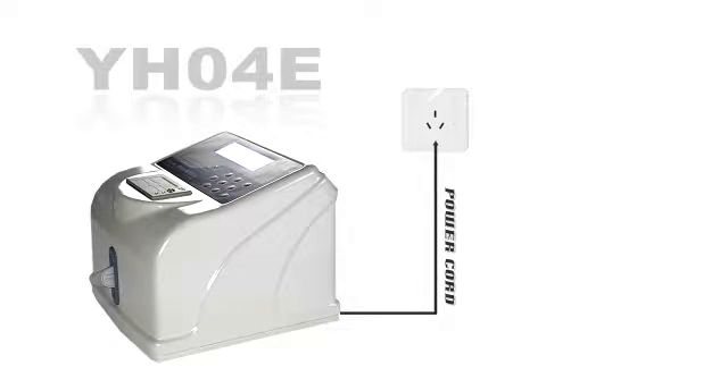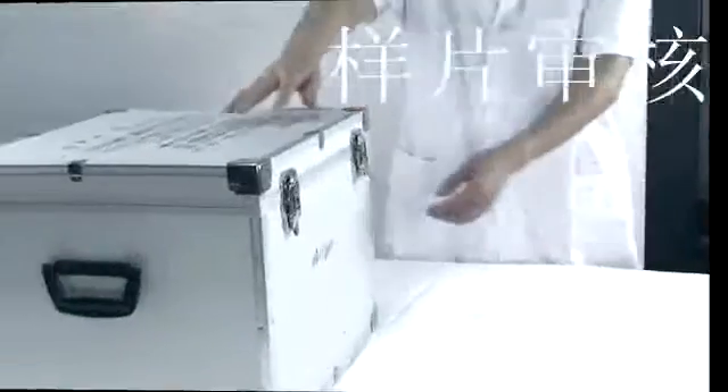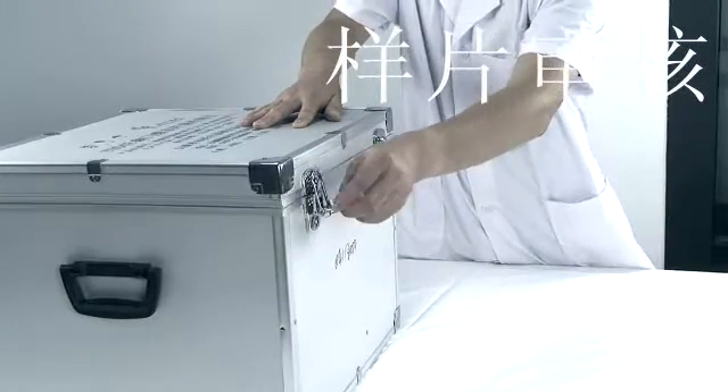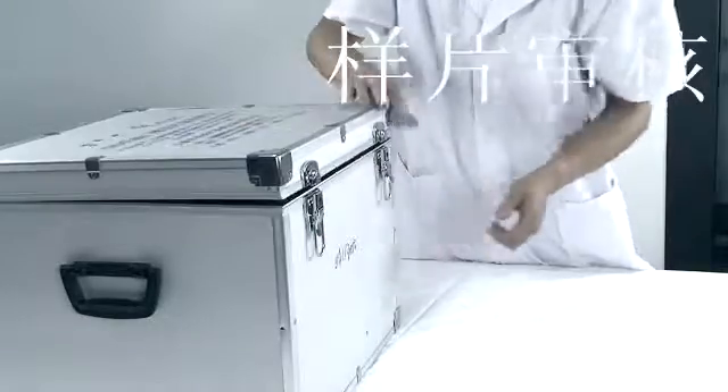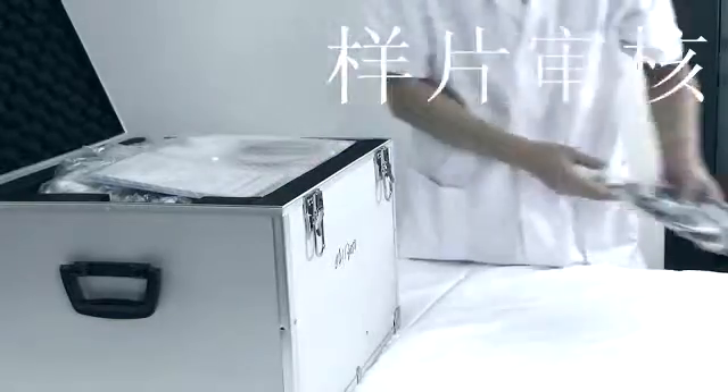The device should be connected to a safety ground and installed as far away from high-power devices as possible. Check and make sure that the packing box is not damaged or upside down when you receive the device. Open the packing box and take out the EPE packing material and accessories along with the device.